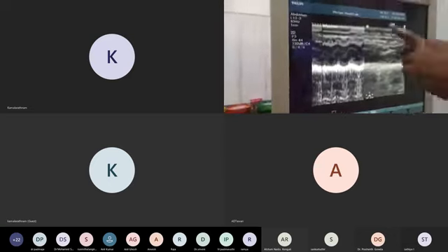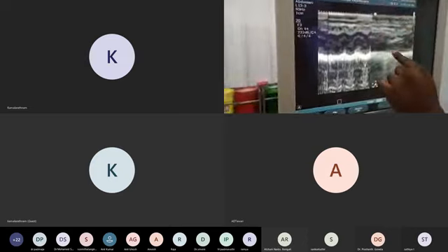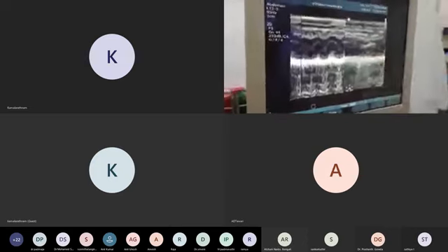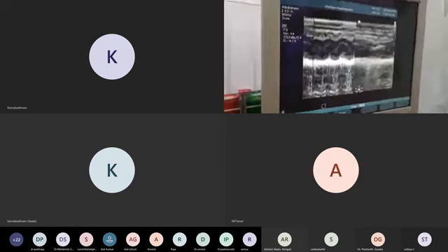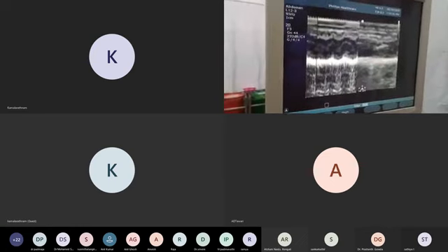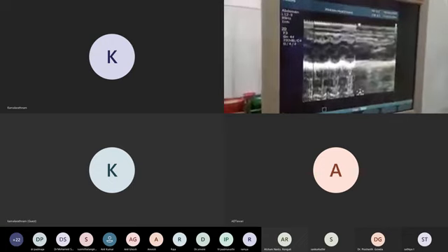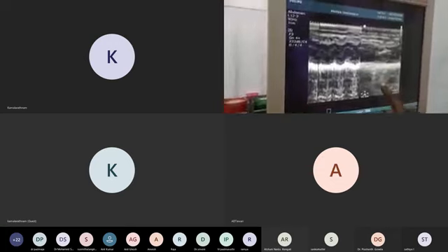Now, the first fixed thing is muscle. The second one is pleura. I told you 2 layers. Suppose it is thin, nice, beautiful like a girl, then it is healthy. Fat, lumpy, bumpy, everywhere lumpy, bumpy, that means unhealthy. 2 things. Come to the lungs now.